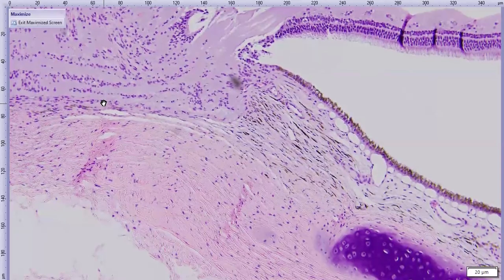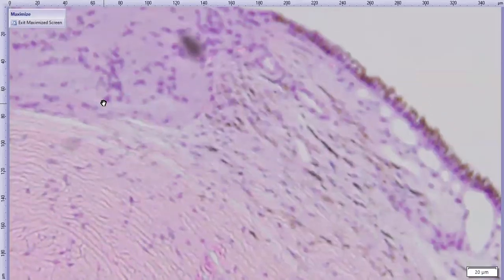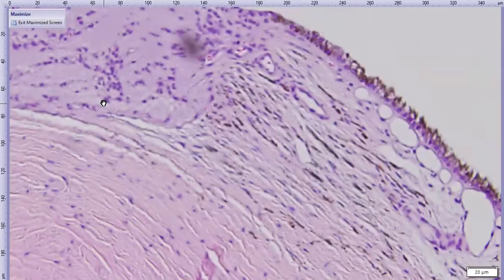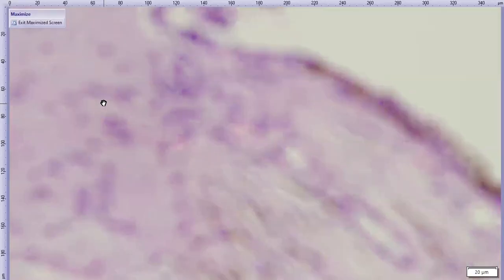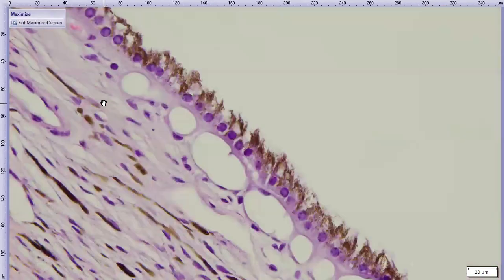Can I ask a question before you move it? How can you tell that the RPE does or does not shade the photoreceptors when it looks like this? Like, what are you looking at that says, oh yeah, that's RPE that shades the photoreceptors? Well, look at the way it is. The pigment extends forward. Let's see if we can find some outer segments embedded in that.